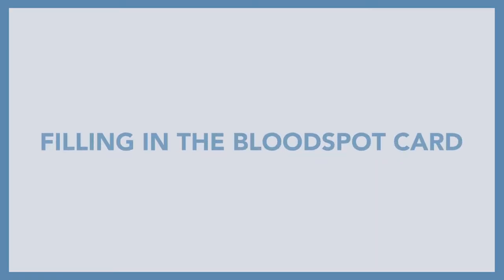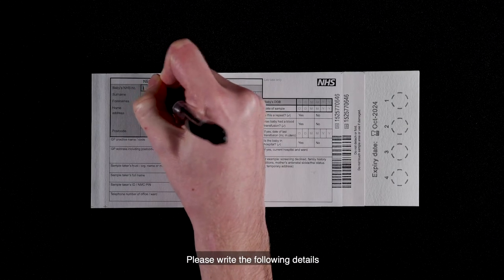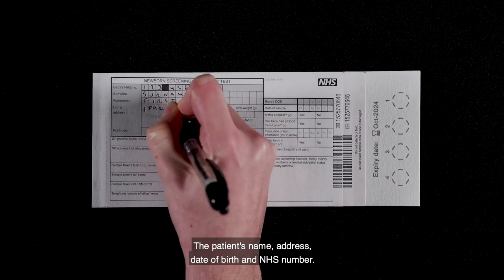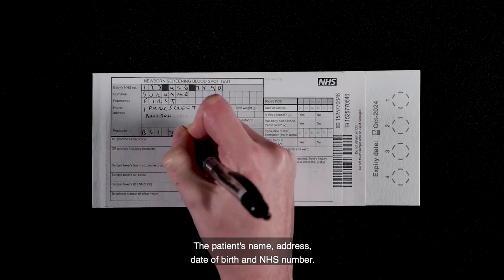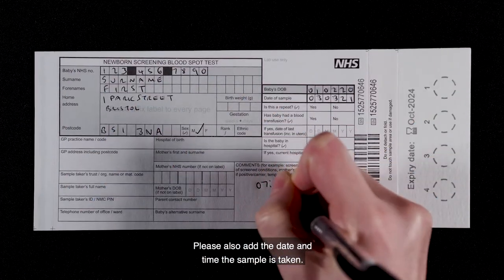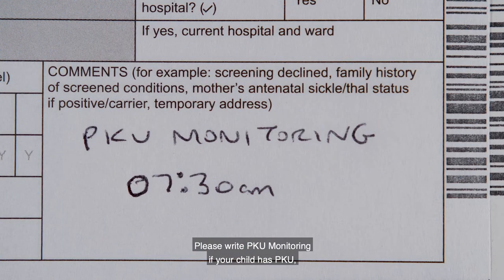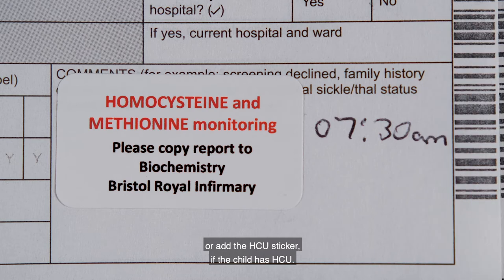Filling in the blood spot card: please write the following details clearly onto the blood spot card — the patient's name, address, date of birth and NHS number. Please also add the date and time the sample is taken. Please write PKU monitoring if your child has PKU, or add the HCU sticker if the child has HCU.